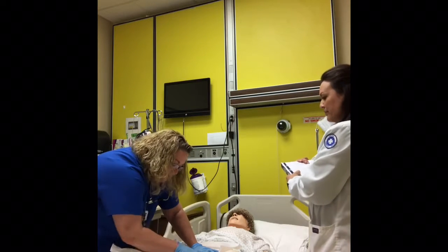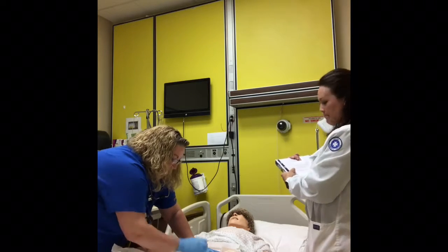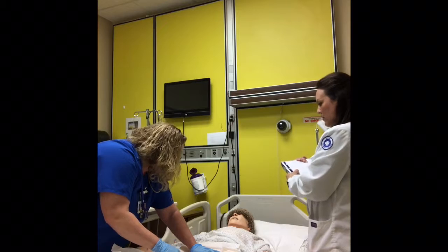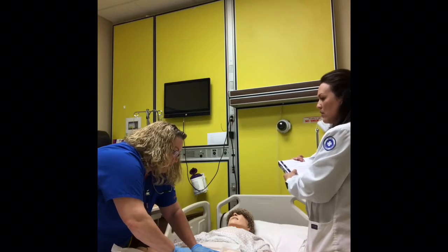So you're going to advance it, advance it, advance it. There I have urine return. You go a little bit more, and then check on the patient. How are you feeling? You're doing okay? Okay, good. Then you're going to push all the fluid in like that. Make sure there's no discomfort.